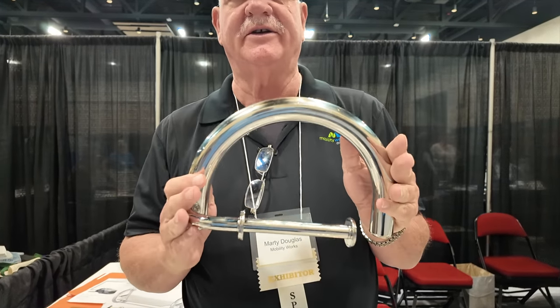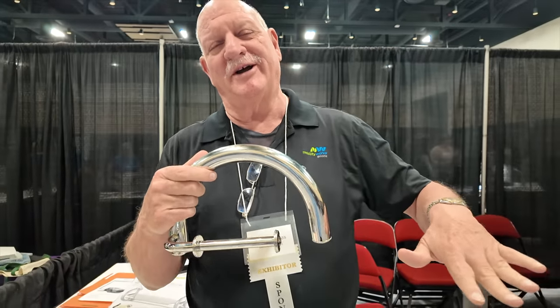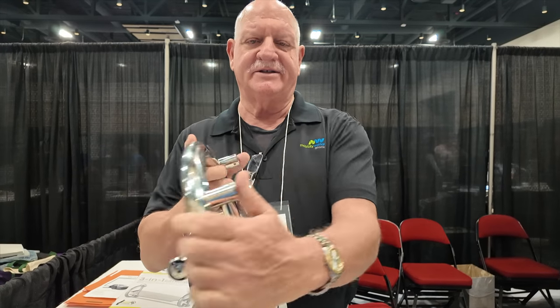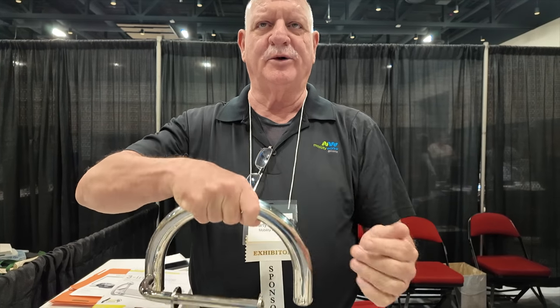This one goes over the toilet. A lot of people would use a toilet roll holder, thinking it would support them when they lift up. Well, this goes into the studs, and they can put their hand here and not mess with the toilet paper. Oh, that's nice. Push themselves up.